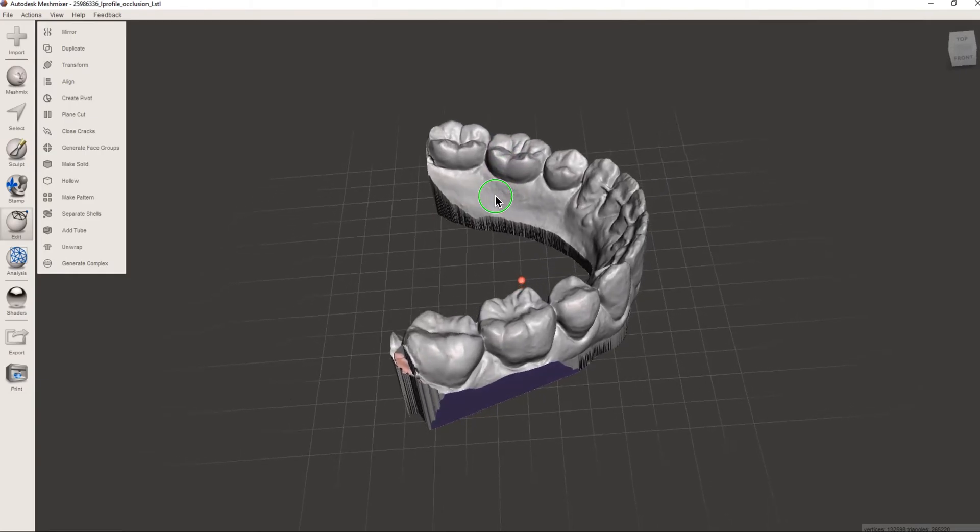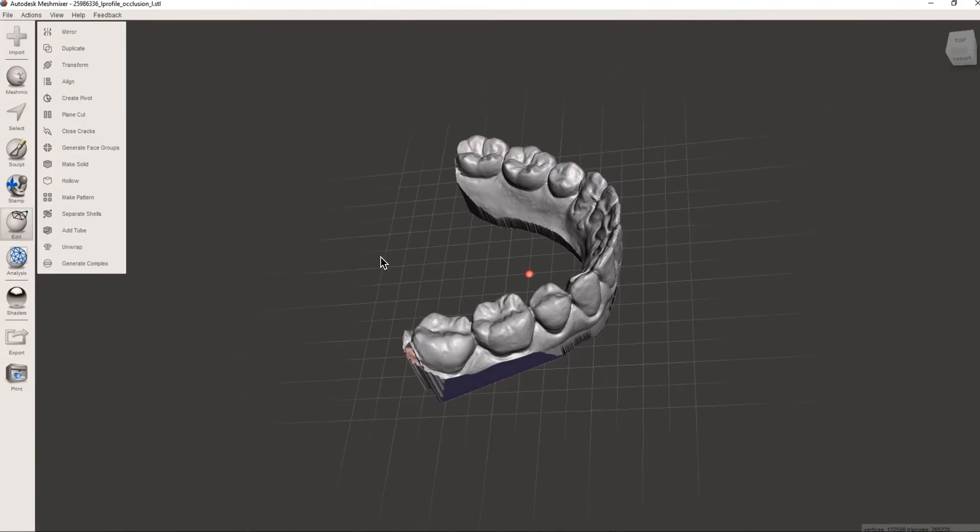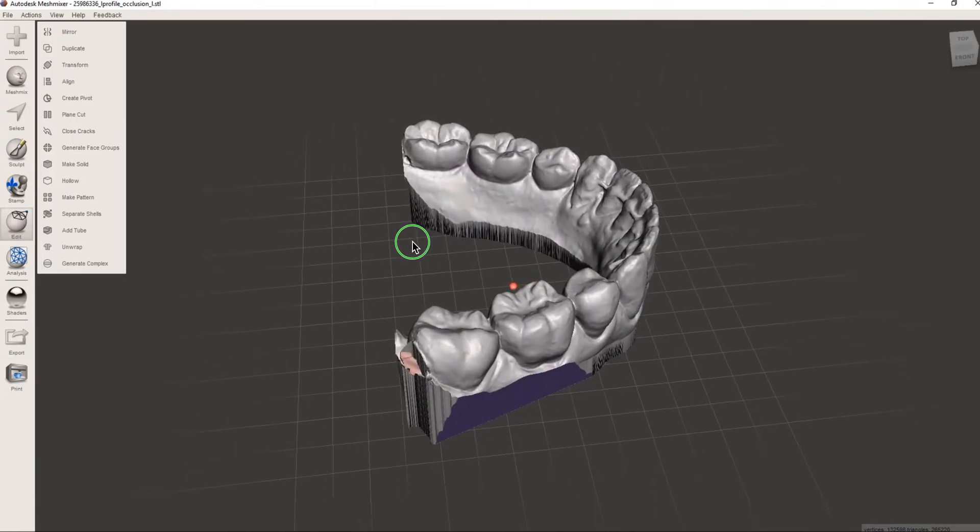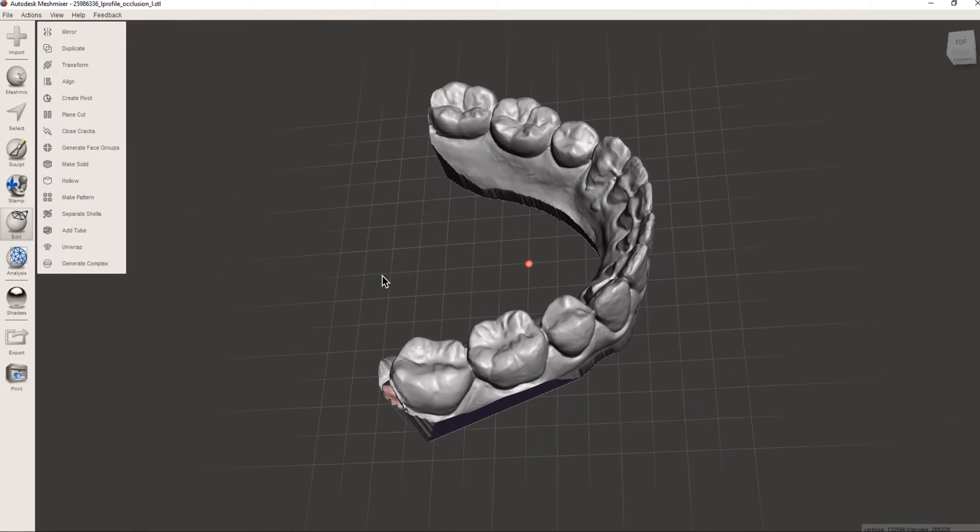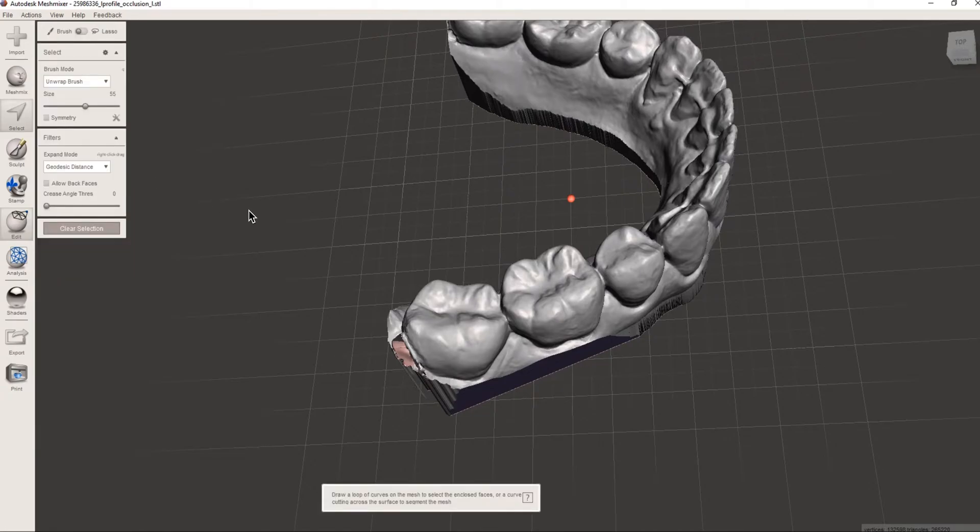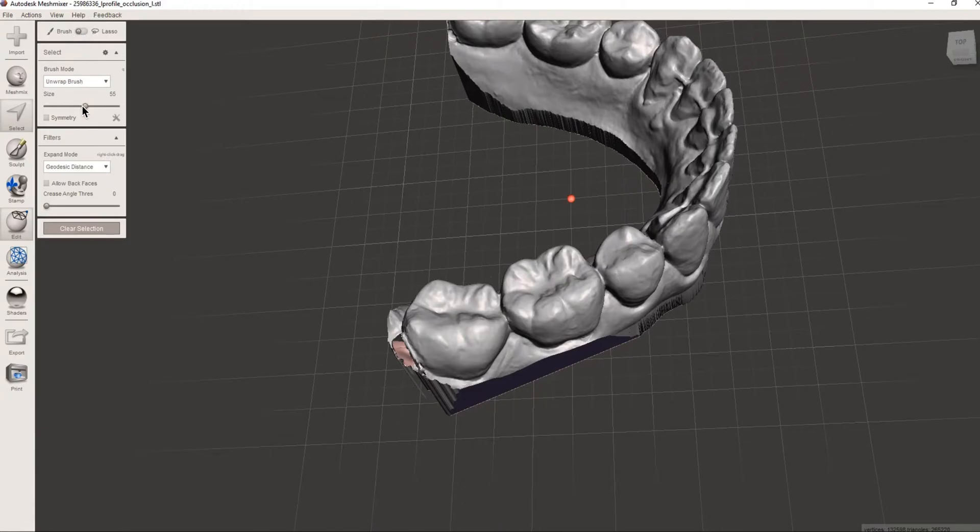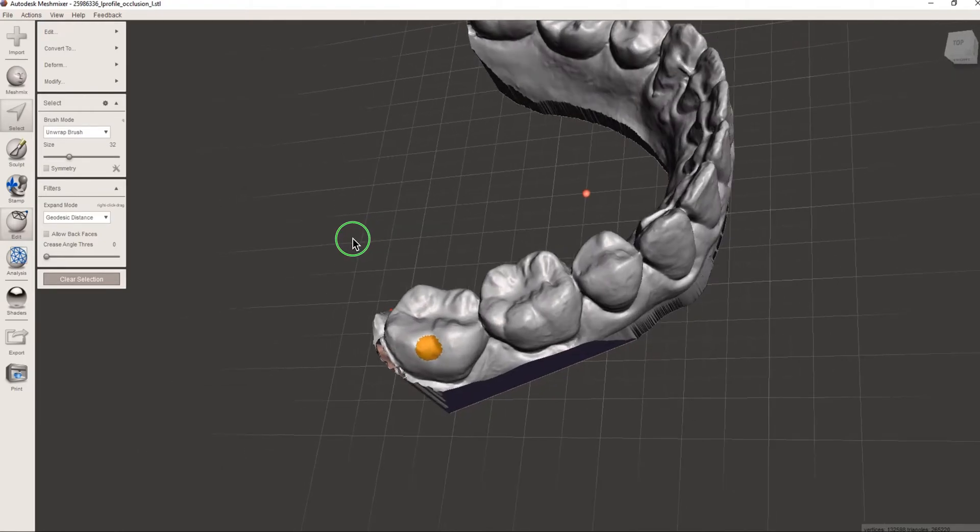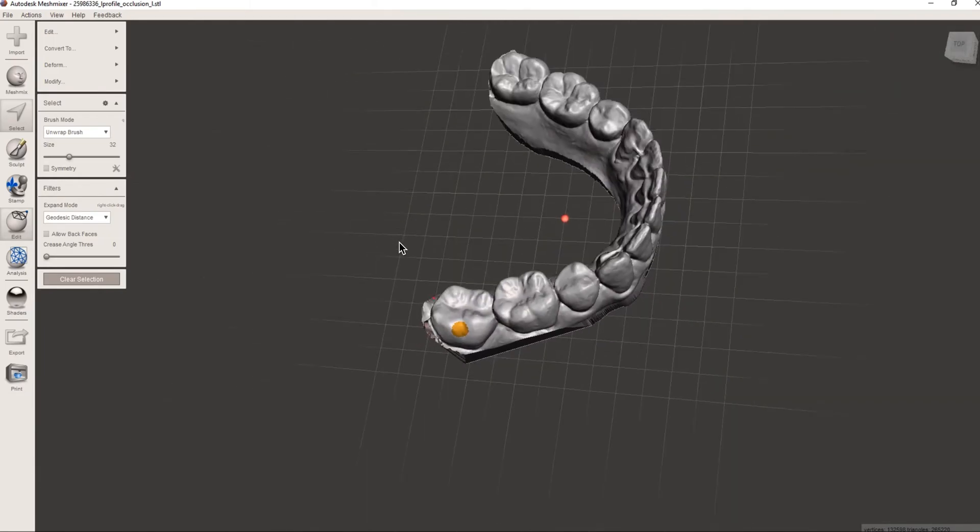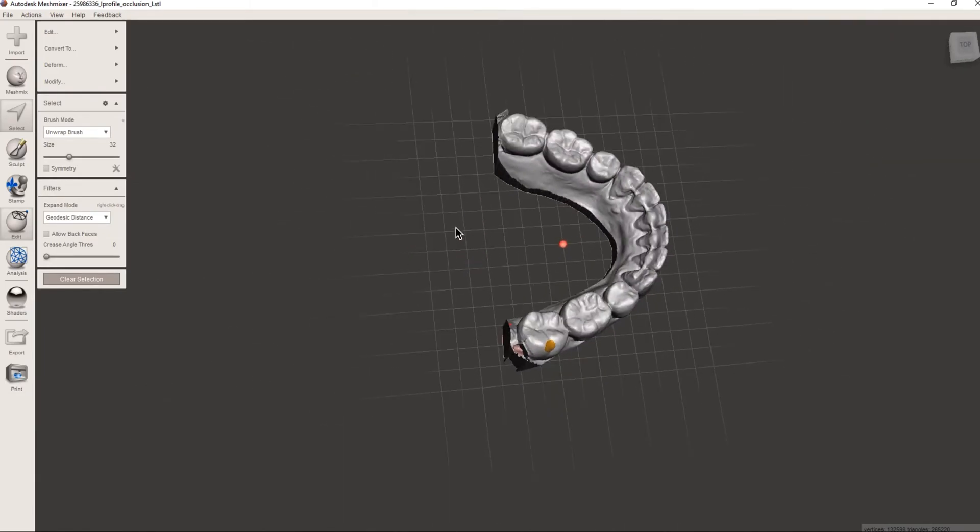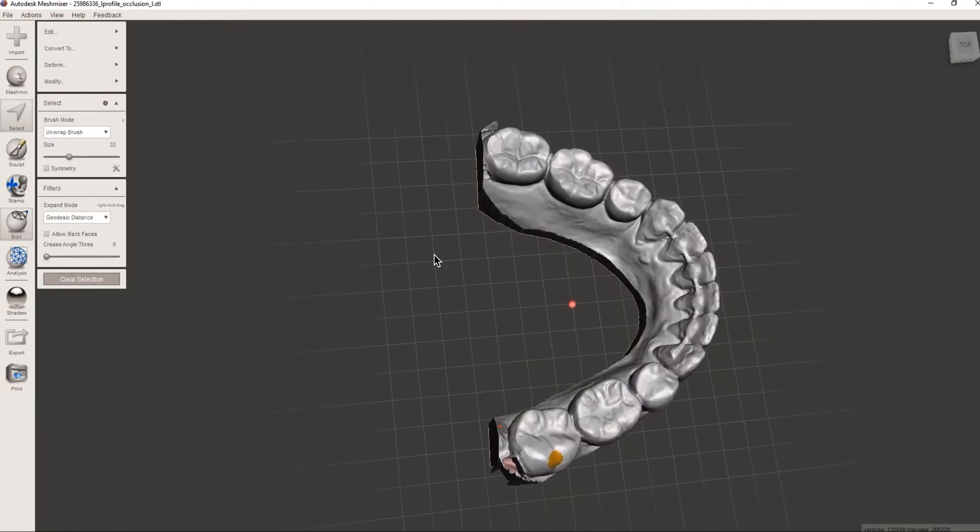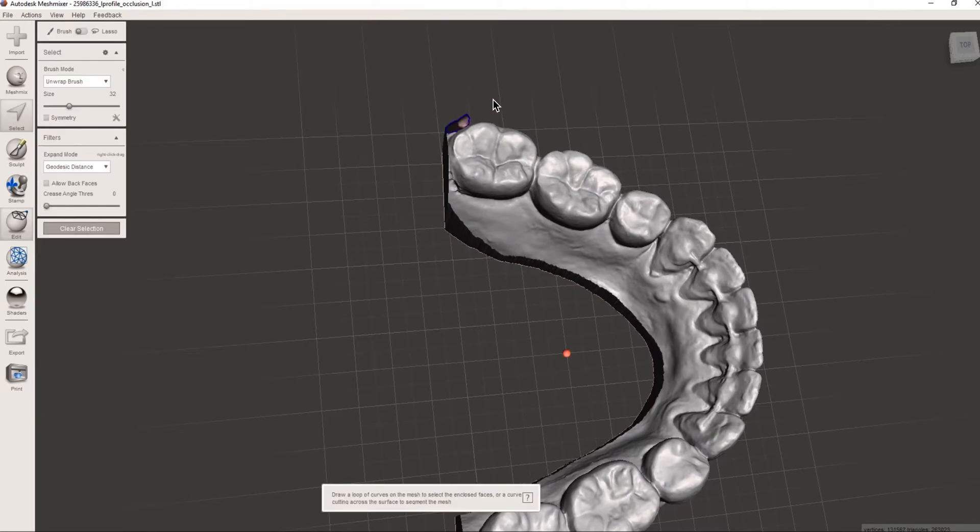And next tool I'm going to show you is the select tool. Now we don't typically really need it in a case like this because this model is pretty clean but this is meant for cleaning up little tiny fragments that you can't get with the plain cut. So in order to activate this tool you hit the S button and you'll see now we have the select options. We can make a lasso, we can make a brush, but we always want to bring the size down a little bit. If we're on brush mode you'll see it'll let me highlight a specific area. So for this little piece over here for example you can highlight it. If you hit the X button and now it deletes it.